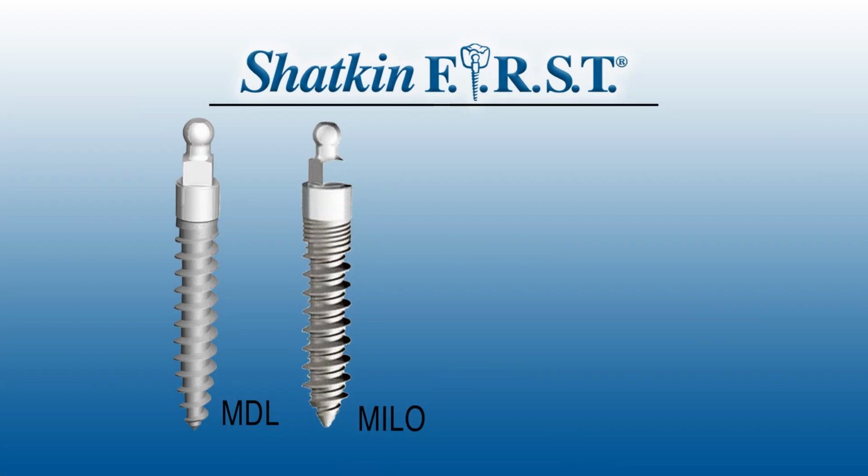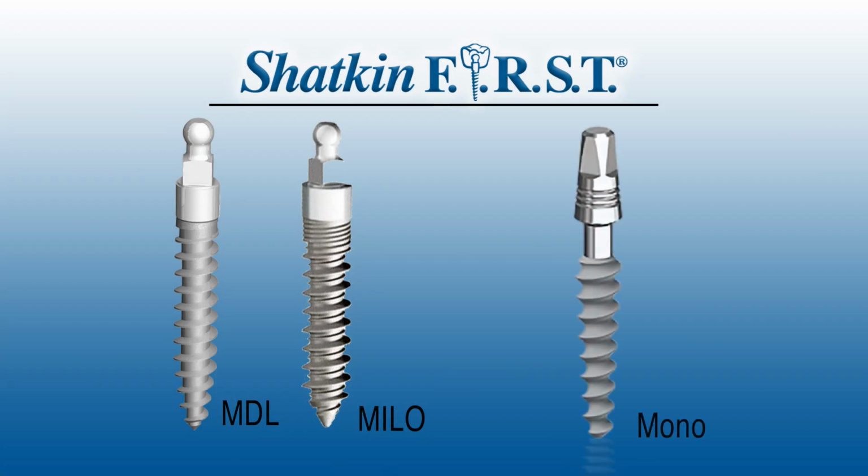This morning, Lenny, what do you want to talk about? So what we're going to talk about today is one of the biggest questions I get from our doctors. They get a little bit confused when we're talking about MDLs, Milos, and the mono implants. So we want to spend some time today diving into the different kinds of implants we sell here, which are really only two types. We have the oval and square, which are the MDL and the Milos, and the mono implant, which has the fixed abutment head. It's a one-piece implant, just those two. So it's oval and squares and monos.